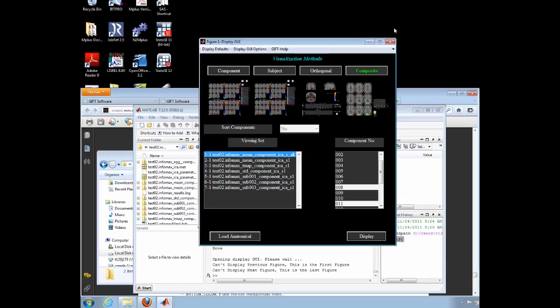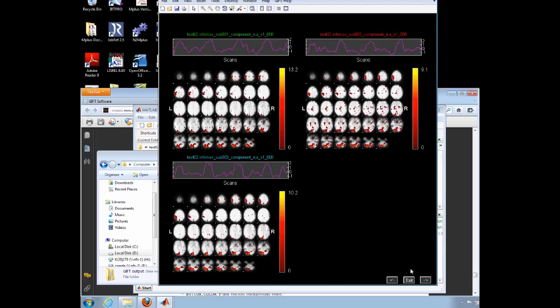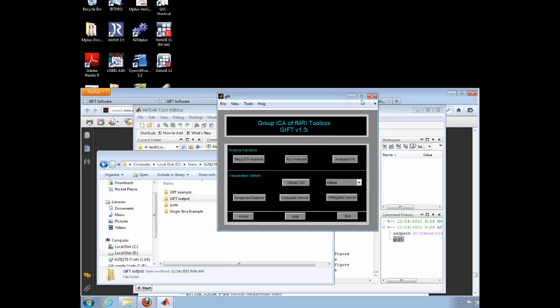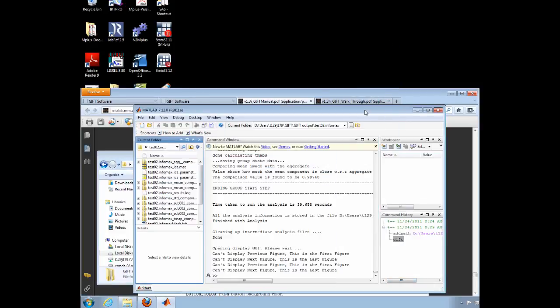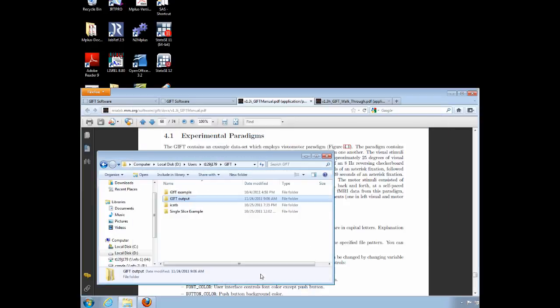There is also the option of looking at a single component and comparing each subject's activation for that component by using the Subject Viewer. When you are finished, click the X and type exit in the MATLAB command window. You will be able to view the results again the next time you open MATLAB.